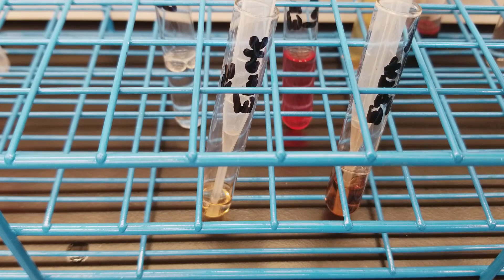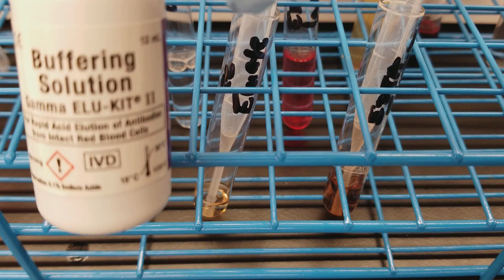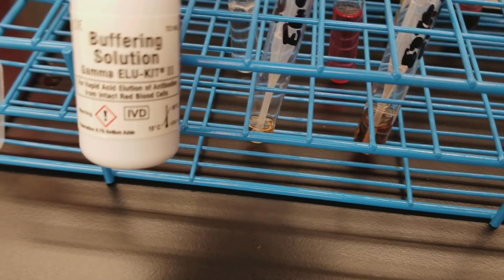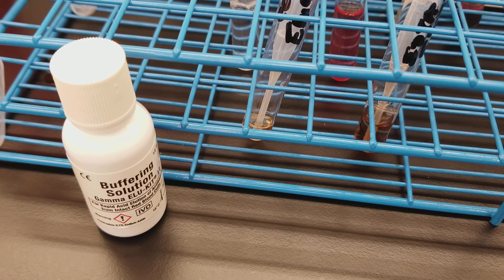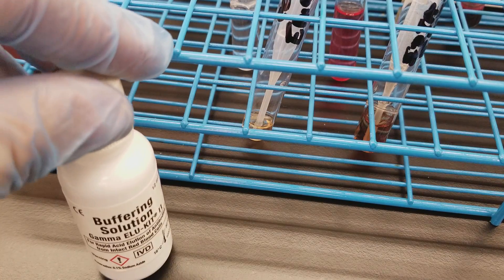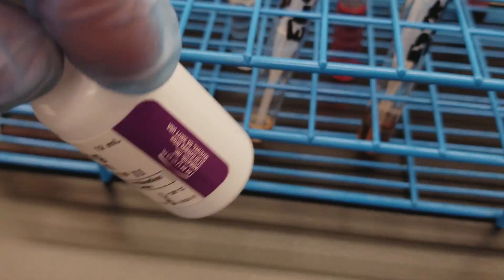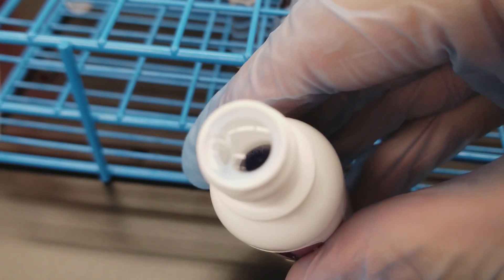Now we're going to add the buffering solution to bring this solution back up to close to neutral, in order for the immunoglobulin to actually do its duty when we go and test it on the antibody identification panel. We're going to open it up first to see if it's blue — if it's not blue, then we can't use it. It's blue! So if it's blue, that means it is at the appropriate pH, and it's going to pull our pH up in the eluate that we have.